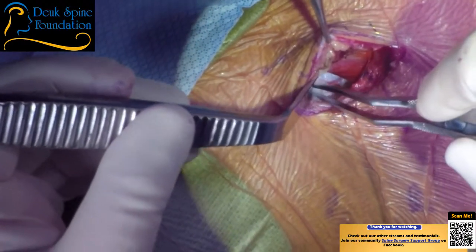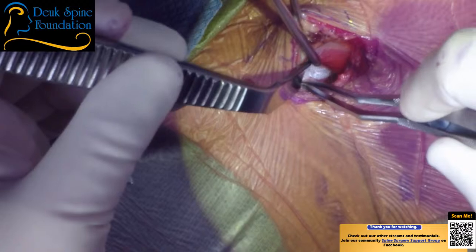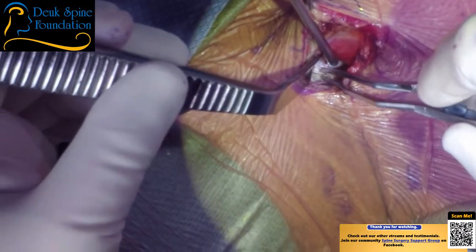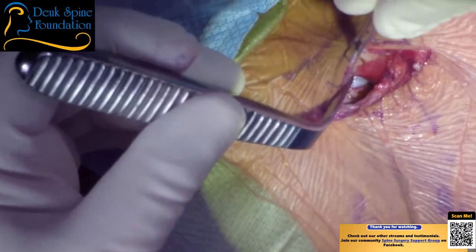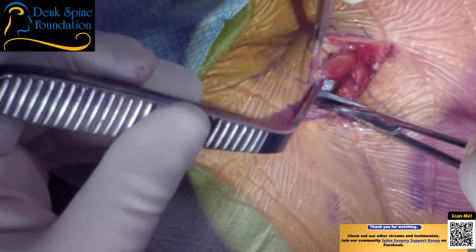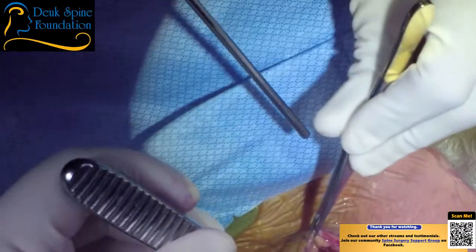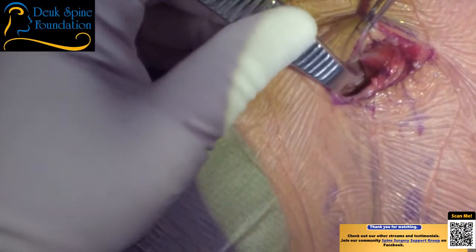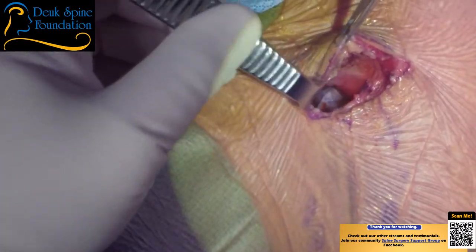Bipolar. And it just makes it a lot harder to do the surgery safely when a patient has a really, really thick neck. So it's a consideration. Scissor. For any surgeon that does anterior cervical surgery, you really want to optimize the situation. Kitty, come on.